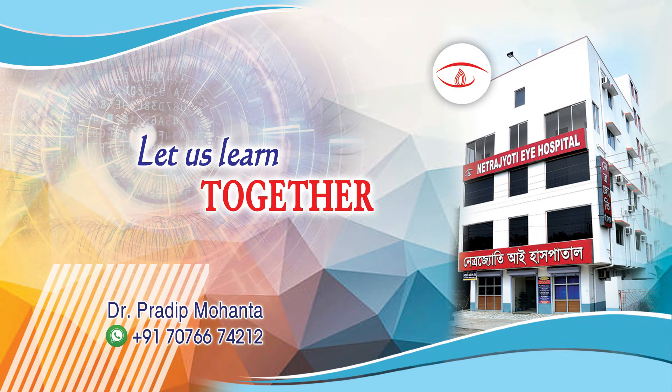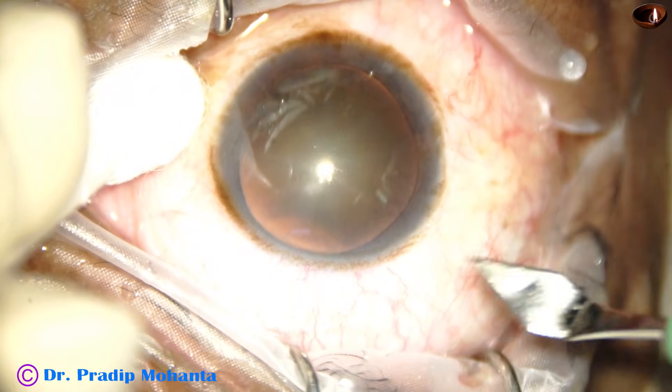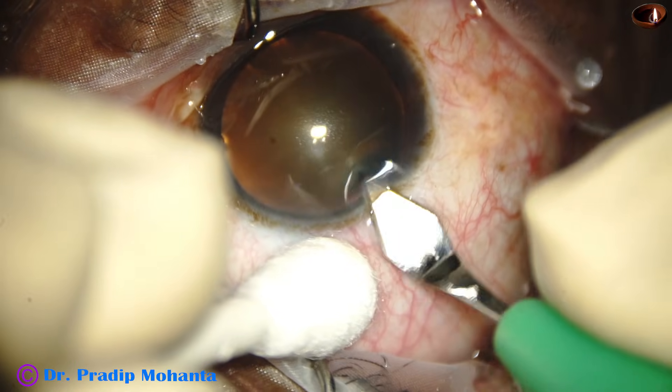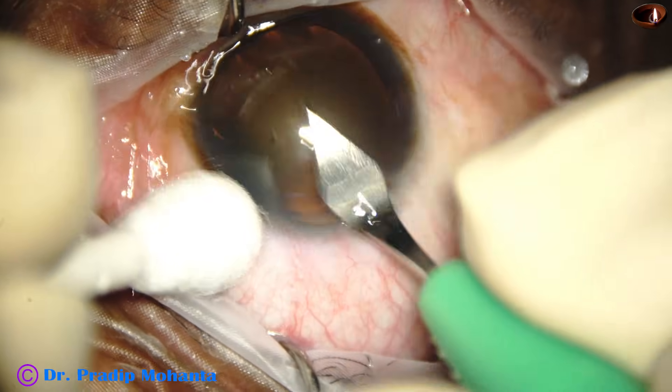Friends, let us learn the lens tilt technique. One way of managing soft cataracts is this technique — the lens tilt technique. Let us see how it is done.